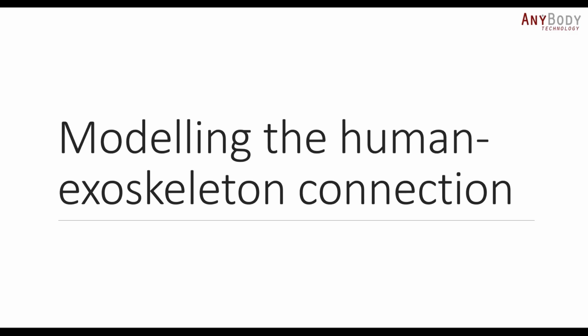And with that, I will move on to the last bit of the presentation. This is about modeling the human-exoskeleton connection, and it's something that you could be interested in when you're in virtual prototyping or physical evaluation, where you have some kind of a model of the exoskeleton.